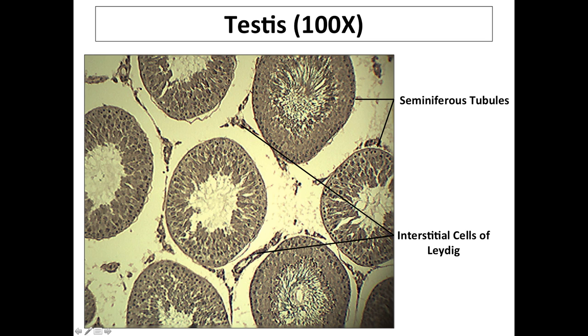So the sperm originate as these tiny cells on the border, and then as they develop tails, they actually move here to the center. Here's some nice tails of spermatozoa that are developing here. When you have follicle-stimulating hormone, FSH, secreted by the anterior pituitary, this is the region of the organ that FSH targets. And it's actually going to cause those cells to proliferate and then to begin their nice long journey.